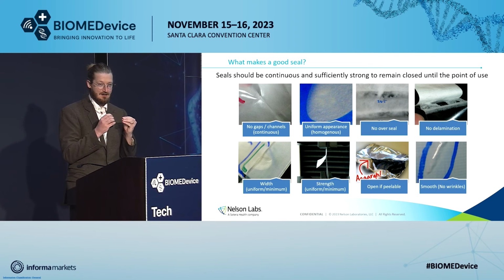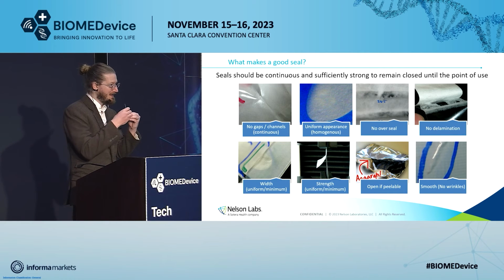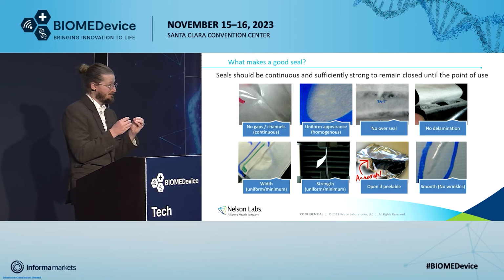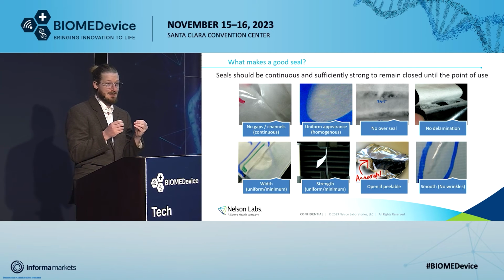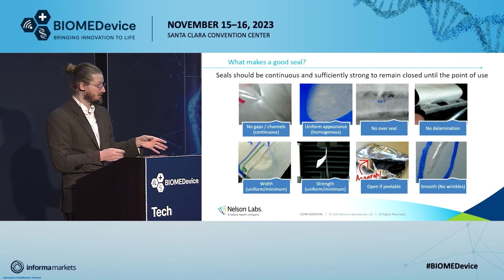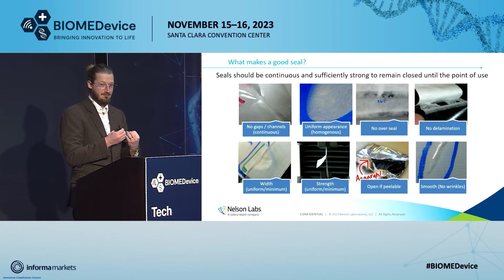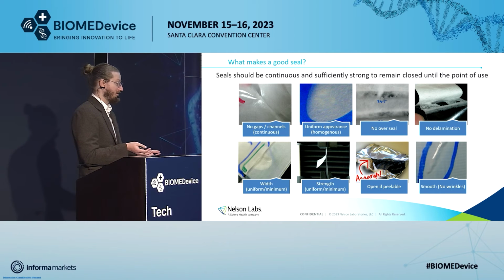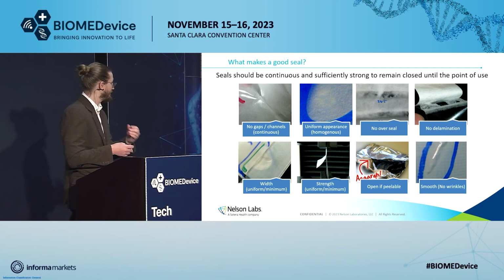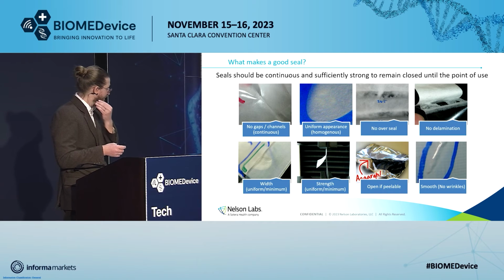Delamination is when the Tyvek portion of it actually sticks to the film and the materials will kind of shear and come apart together. That's particularly risky because we challenge with Bacillus atrophaeus spores, and any of these spores trapped in the fiber kind of release and break free when delamination occurs. So if this is happening in a surgery environment, if it delaminates, whatever was on the outside might break free as you're opening it.